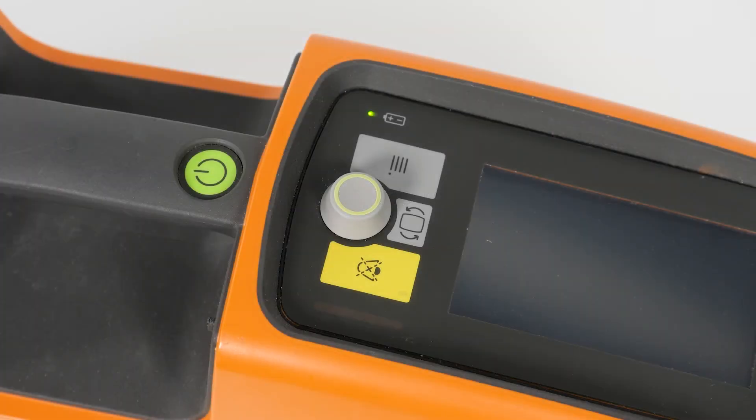The LED next to the battery symbol lights up when an external power source is connected. A two-coloured indicator lights up to show the current state of battery charge. Flashing green indicates that the battery is charging. Lit green indicates that the battery is fully charged. If the LED lights up yellow, this indicates that no battery is inserted or the battery cannot be charged.